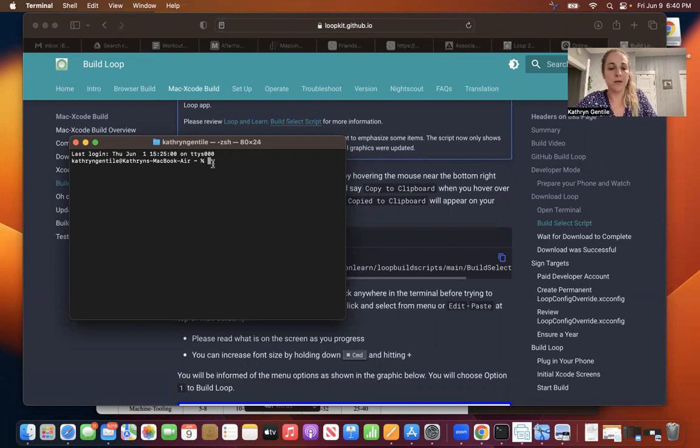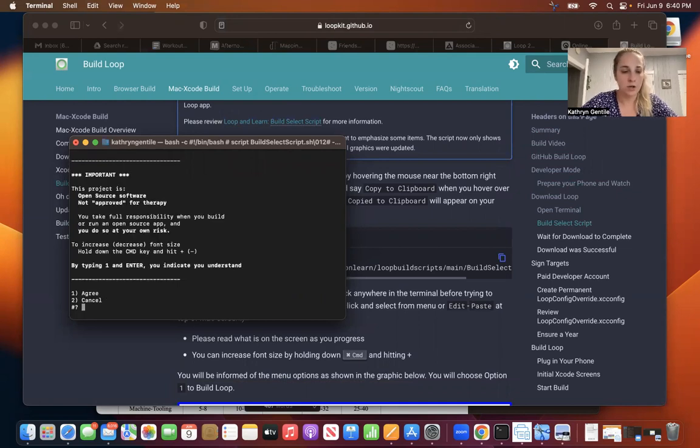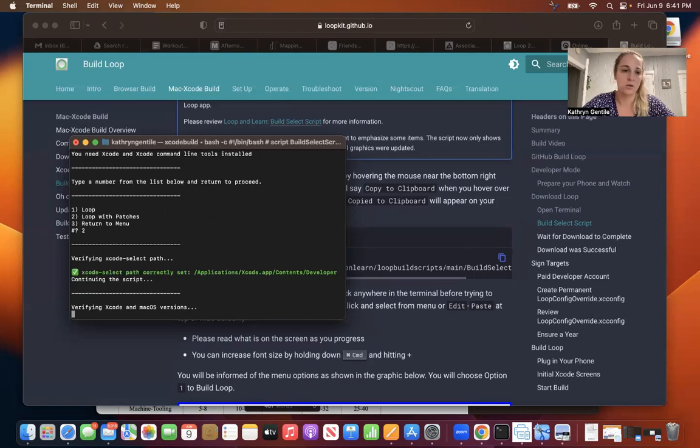Right here, we're gonna command V and press return. We are building loop, so one return. We agree that this is open source. Then you can select here either build loop or loop with patches. If you're not sure, or you think maybe you want to use the patches, but you don't know much about them yet, just select that because they're all going to be default off. So if down the line you decide you want to use them, you can, and you won't have to do a rebuild. So I'll just go ahead and select two.